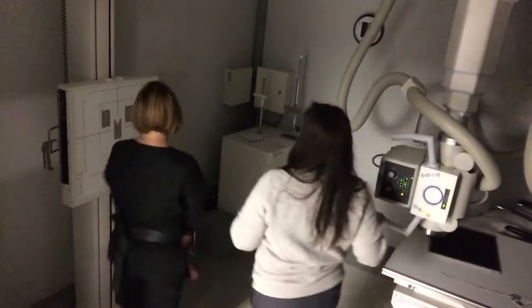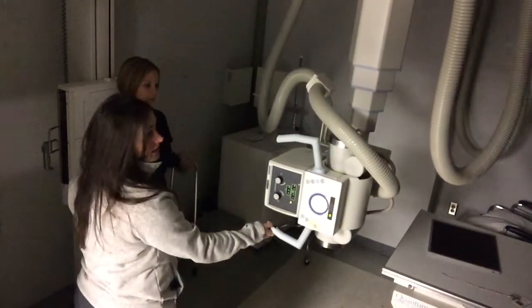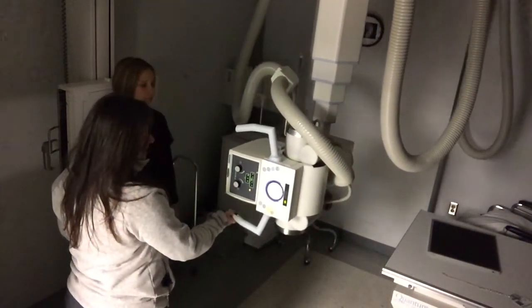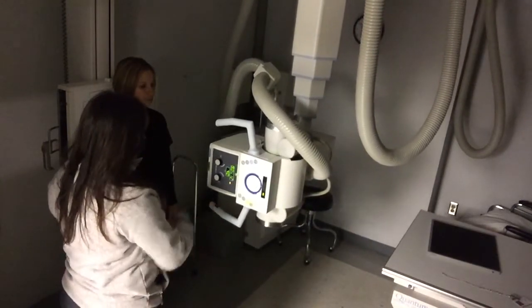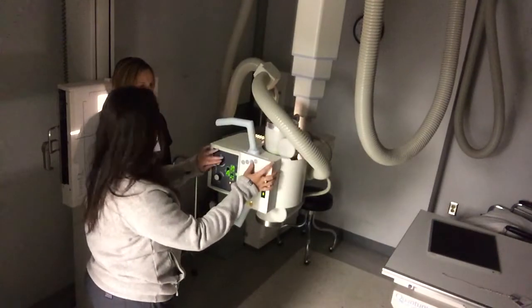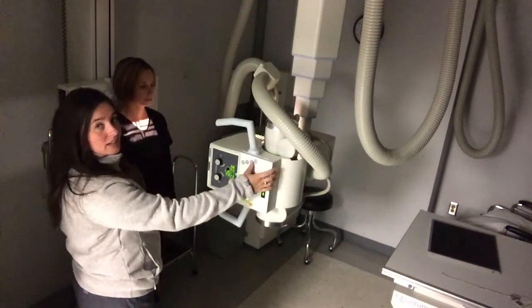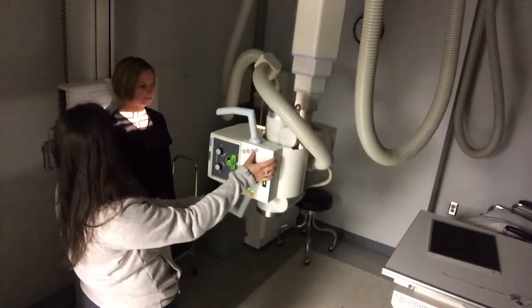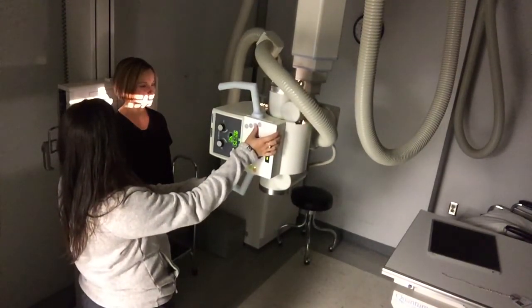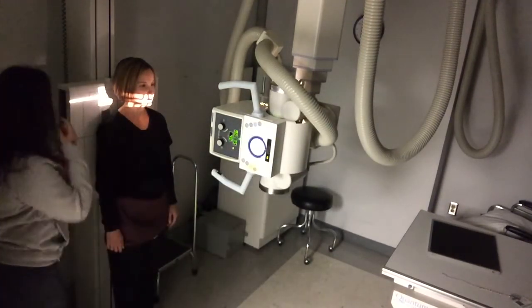I'm going to go ahead and start with the open mouth because it's a little bit different. It's at a different SID. So we're going to be in detent here at 40. And then I'm going to raise my light up. I'm just going to get it in the ballpark here first, and then later I'll adjust it. But I'm going to first kind of collimate down so I don't blind her when I raise this up. And I usually put the centering point right below the mouth, or right at the mouth there to start.